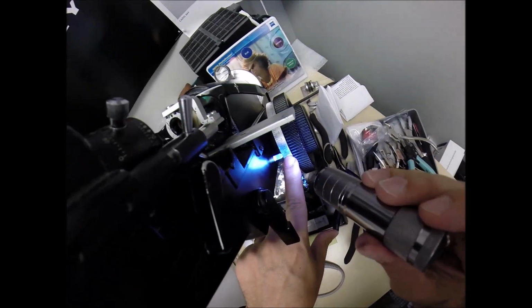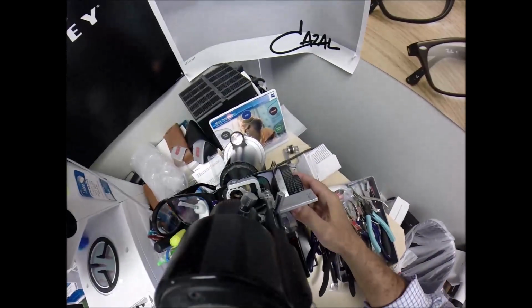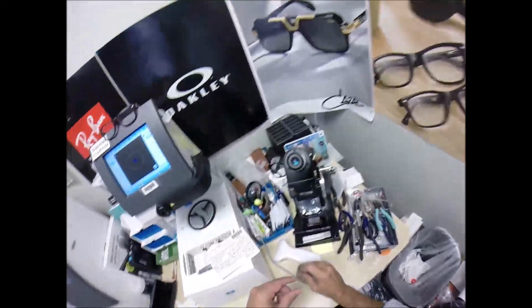So, +1, exactly halfway between 0 and 2. That's where you're going to find 1. When I'm looking inside, I can't see what you guys are seeing, but 3 skinny lines come into focus. And then I'm going to check the Astigmatism Correction, and then 3 thicker lines further apart should come into focus. Let me look in there and see. And they did. Yeah, there we go. Now you see the 3 thicker lines. At least I hope you do. Again, I can't tell what the GoPro is seeing inside the eyepiece.